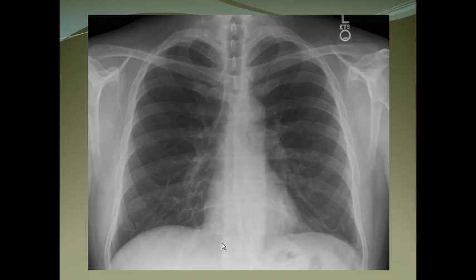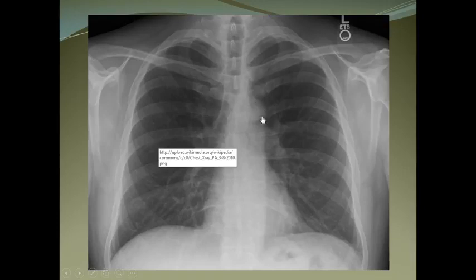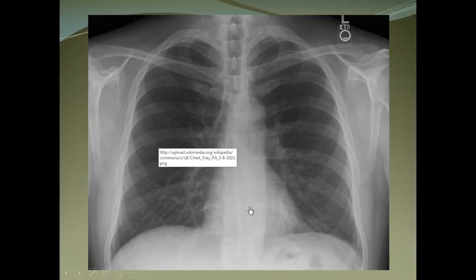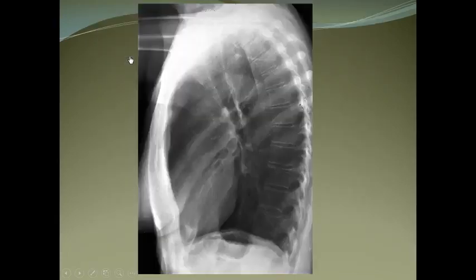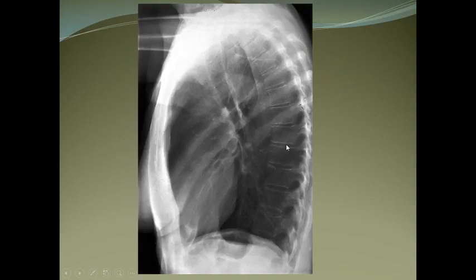On the normal X-ray, you can see the clavicles, trachea, spinous process, pulmonary trunk with its convexity, and the aortic arch. These are the heart borders. The heart is in the midline, along with the costophrenic angles and ribs.